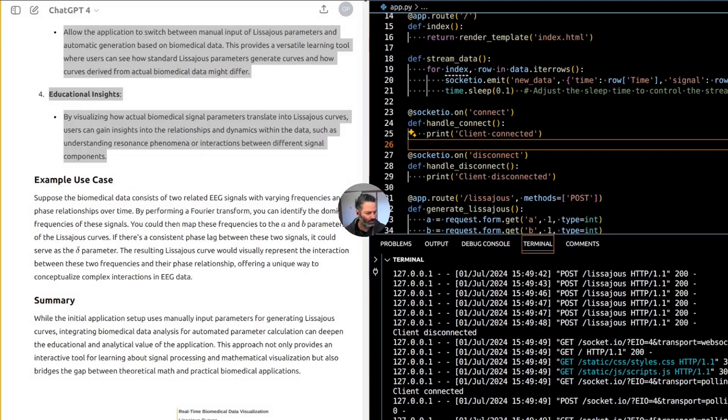This provides a versatile learning tool where users can see how standard Lissajous parameters generate curves and how curves form from actual biomedical data.